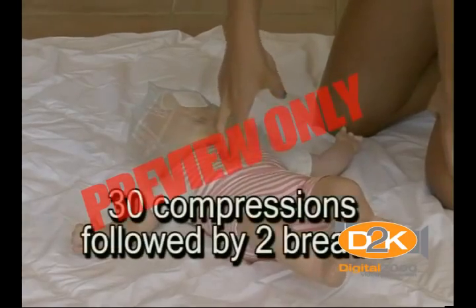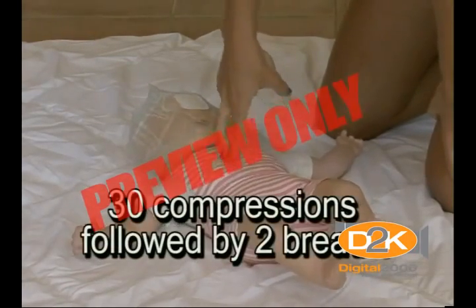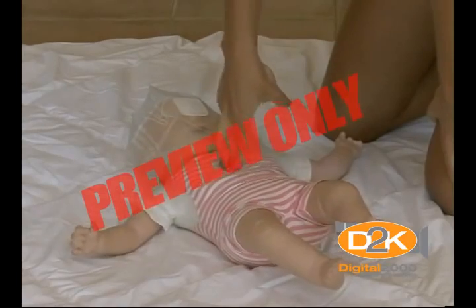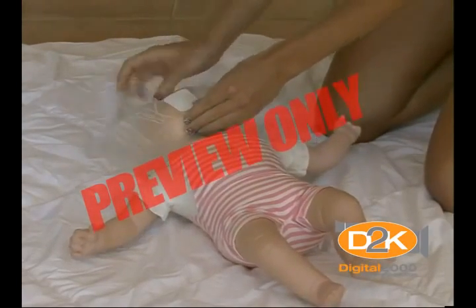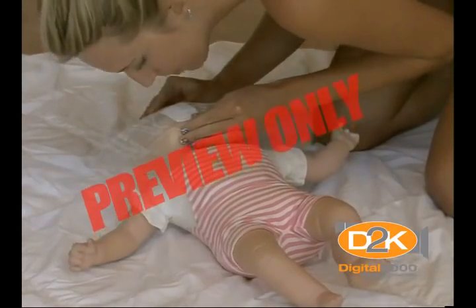Continue to perform 30 compressions followed by 2 breaths until EMS arrives, an AED arrives, or infant shows signs of life. Once an AED arrives, immediately place it into operation.